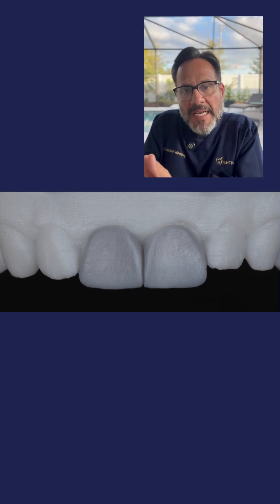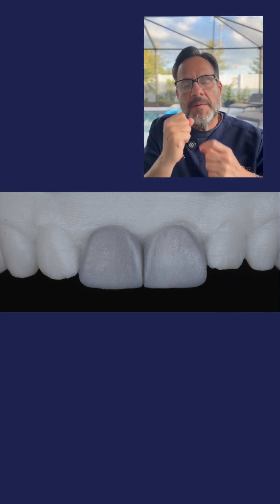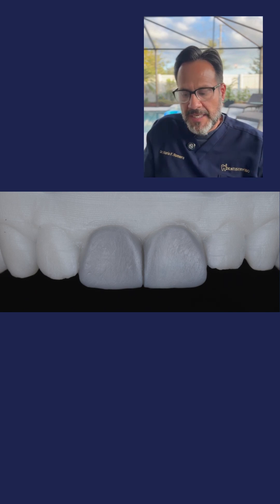Because if I don't do that, I'm going to end up with a crown that appears to be darker compared to tooth number nine — eight compared to tooth number nine.